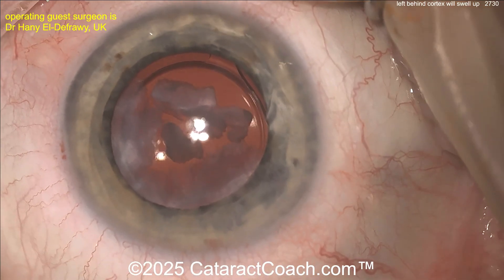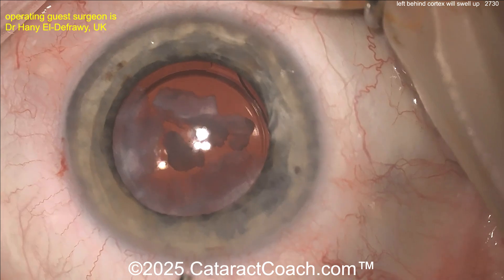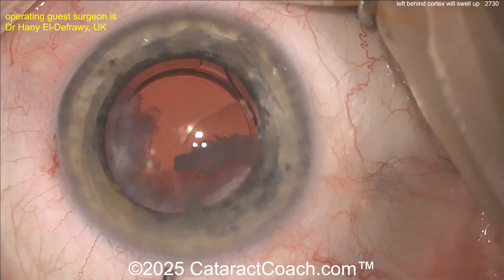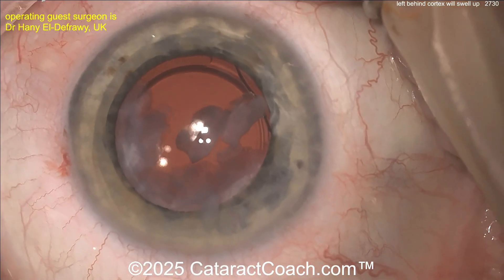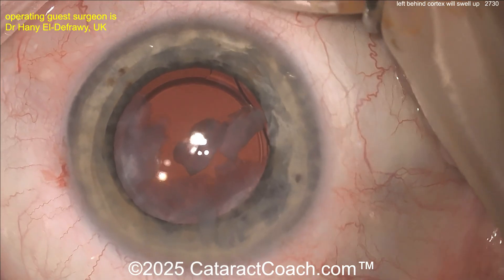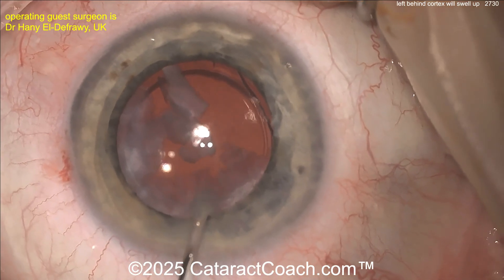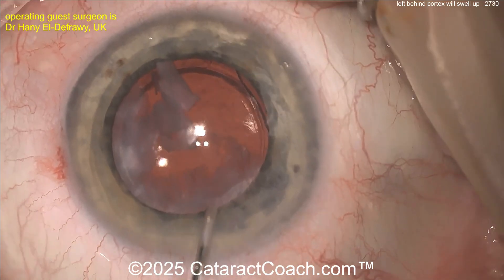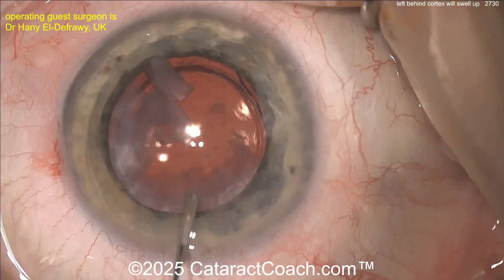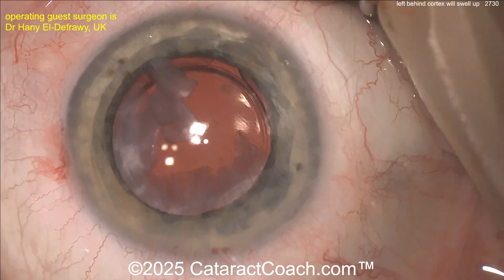The problem is it's going to fall into the visual axis. When you see the patient on post-op day one you're thinking, where did all this come from? It swells up to many times its normal size — a little bit of cortex may become three, four, five, six, seven times as big. That's because the lens proteins mix with the water and aqueous in the eye and just swell up to a huge size.